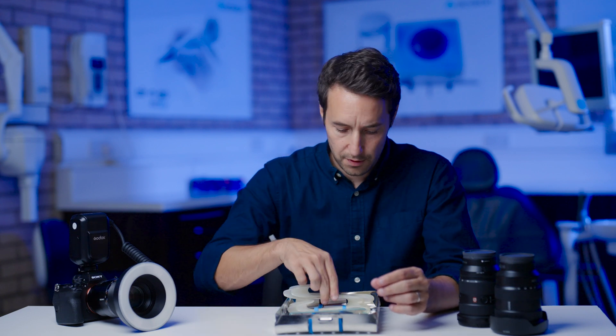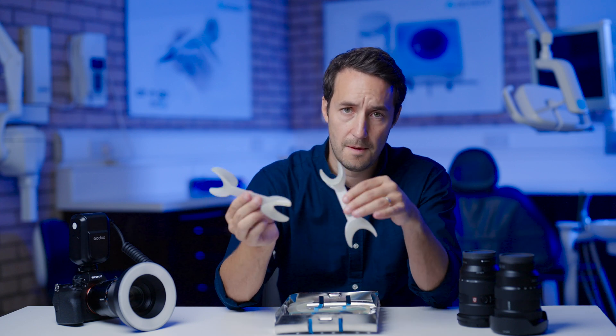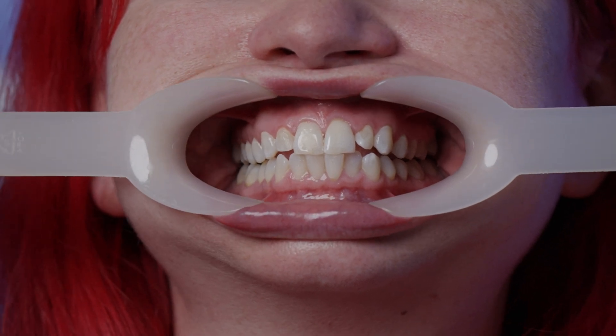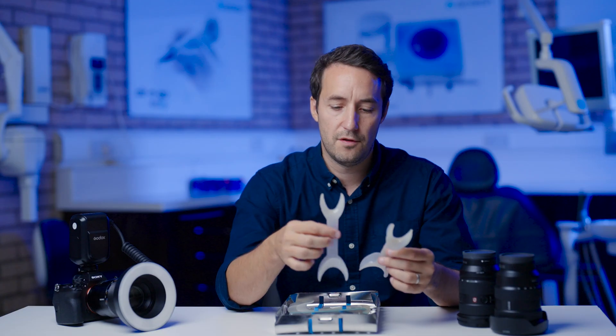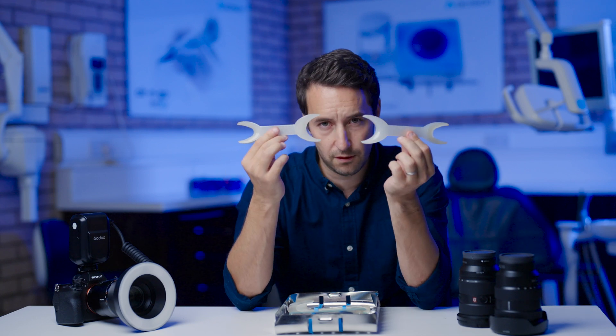For general retraction of the lips during anterior and oblique views, we use the small side of the large retractors, which provides adequate retraction to expose the surfaces of the teeth and suits 90% of patients. You could use the larger ones, but most patients are slightly uncomfortable with that size.